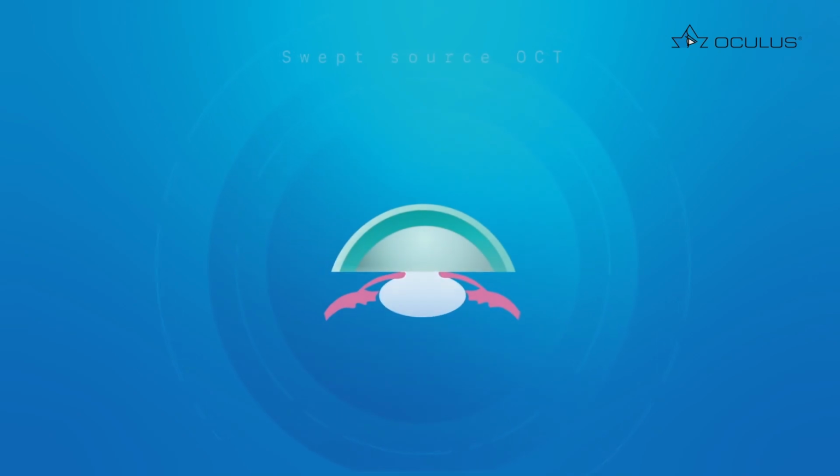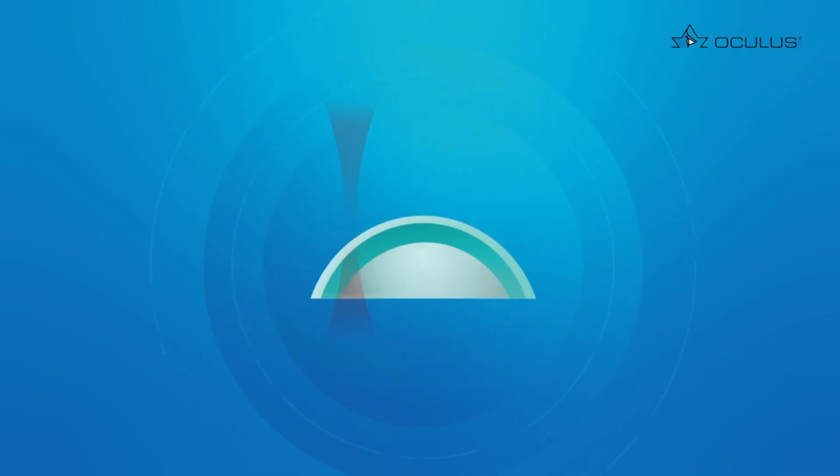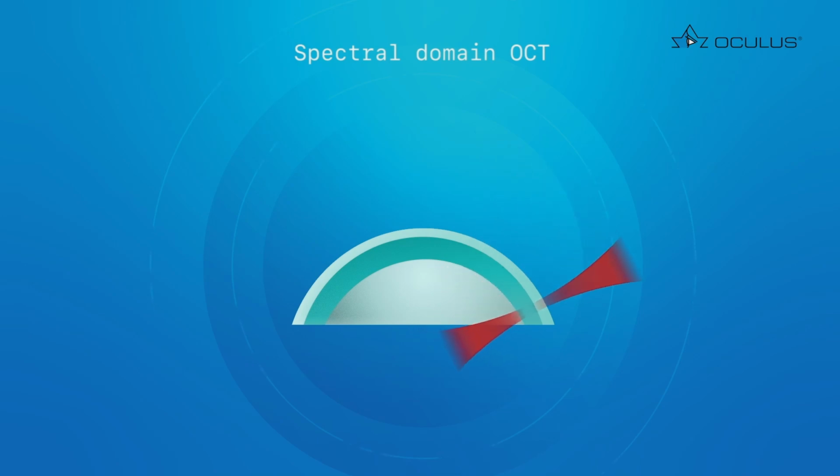We can scan the cornea from the anterior to the posterior surface. All the layers of the cornea and all the diseases that affect those layers are potential good domains for this instrument to give us interesting information.